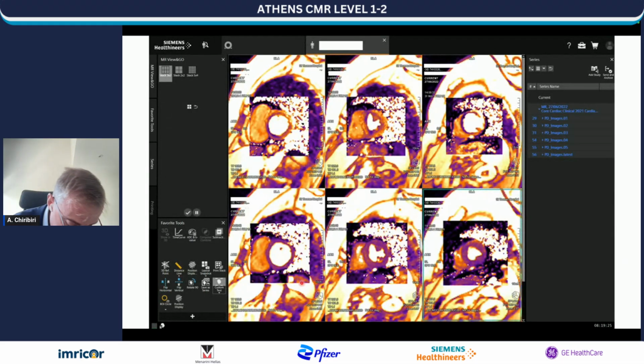And a very frequently asked question is whether you need to install additional hardware to obtain this. Well, the answer is no. This is a software update. Any current Siemens scanner can do this without installing any extra computers, which actually makes it so much easier to deploy. Certainly, there are other solutions which require installation of computers like Gadgetron, but we realize that installing additional hardware, which is not FDA approved, and giving access to third parties on hospital networks is not necessarily the thing you want to do with your scanner, or something that the IT service of the hospital will allow you to do.